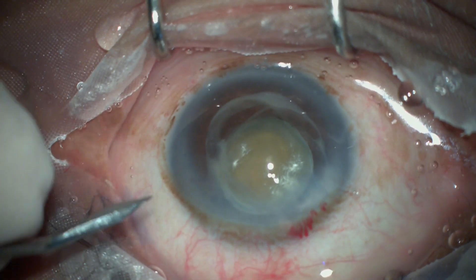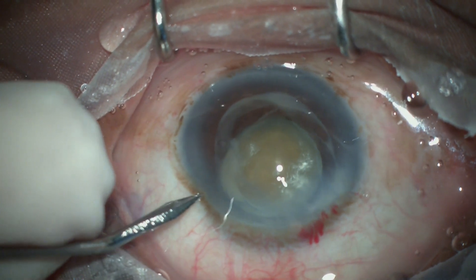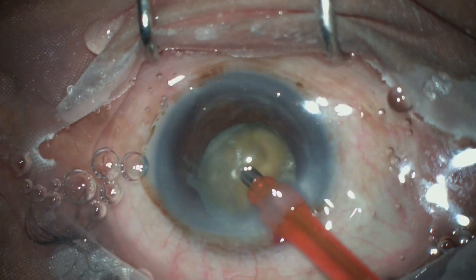Once the cortex has leaked out, we can now see the brown nucleus. A side port is made and we proceed to phacoemulsification.